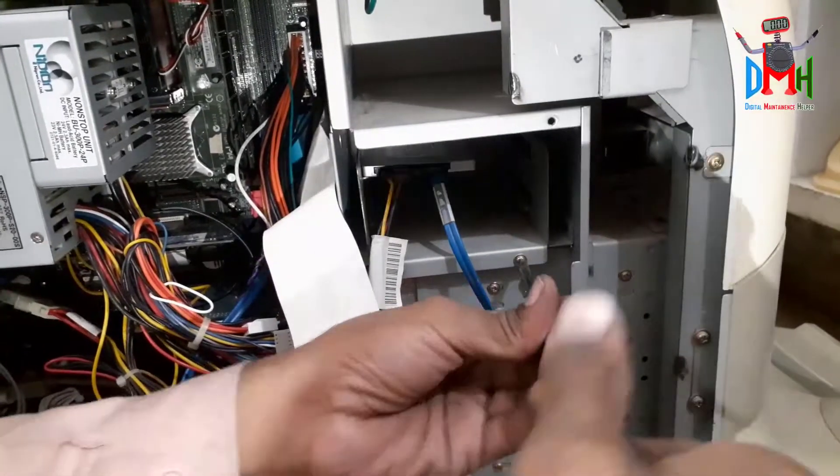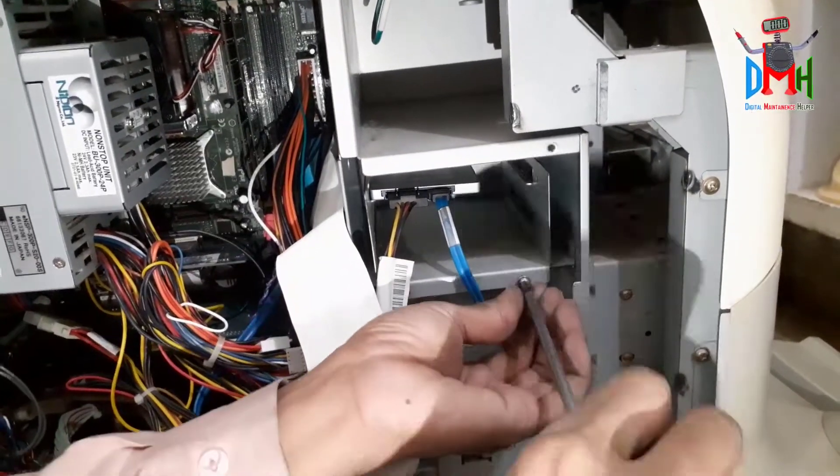Now I will change the hard disk and its software.